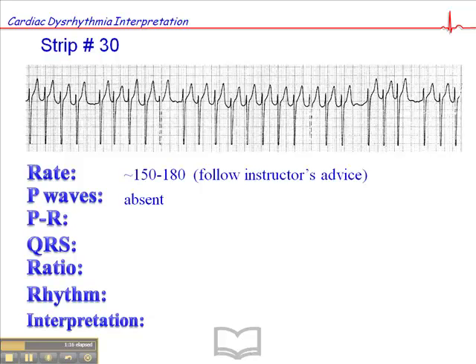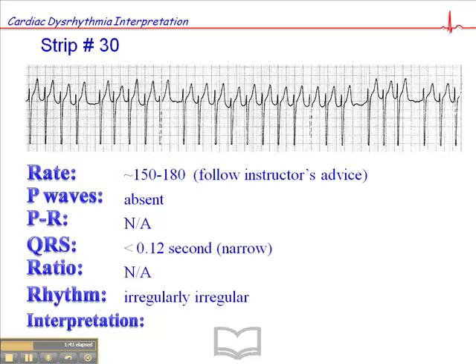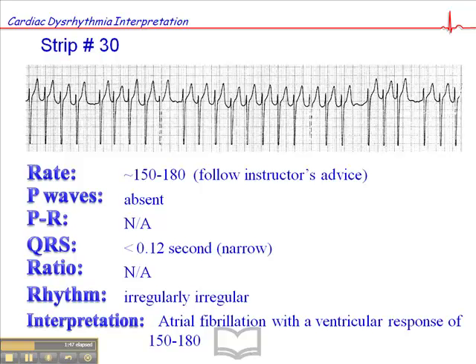Now there are no clearly discernible P-waves here. You may see some glitches, like here and here. Don't get sucked into the glitches. This rhythm is irregularly irregular, and guaranteed you're going to see some artifact between the QRS complexes, but there are no clearly discernible P-waves here, and therefore there's no PR interval. The QRS is narrow — it's less than 0.12 second. The ratio is not applicable. The rhythm is irregularly irregular, and when you have an irregularly irregular rhythm, the interpretation is atrial fibrillation, in this case with a ventricular response of between 150 and 180.